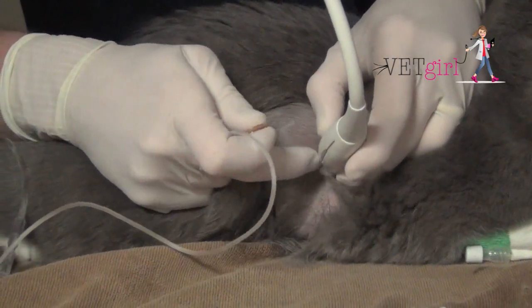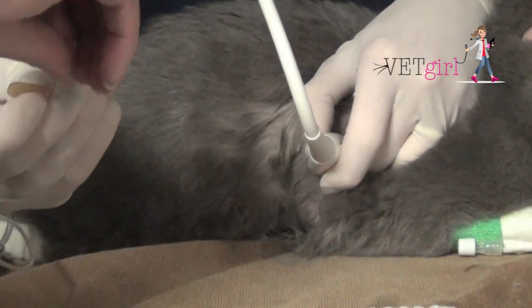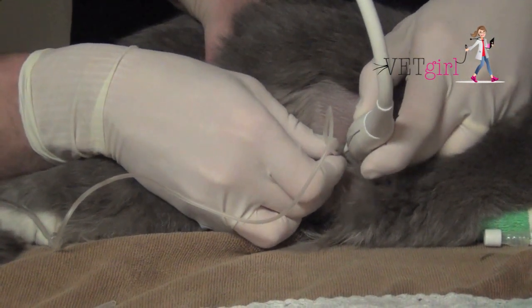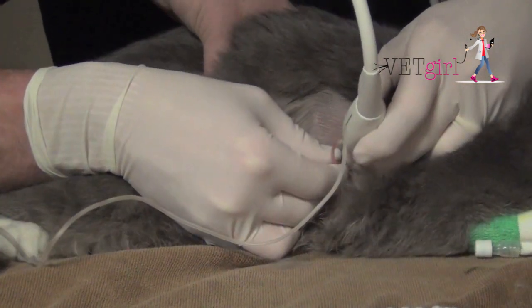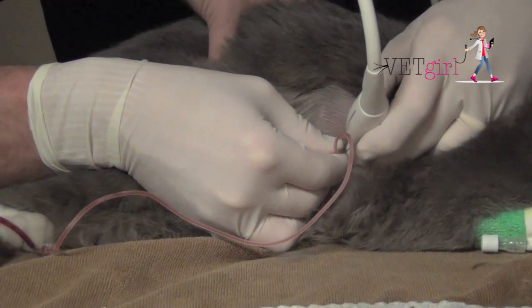You want to use sterile technique, a three-way stopcock set up with a butterfly catheter and syringe. We typically want to go in the seventh to ninth intercostal space, ideally cranial to the rib to avoid the vessels and the nerves, evacuating as much pleural effusion as we can to make the cat comfortable.